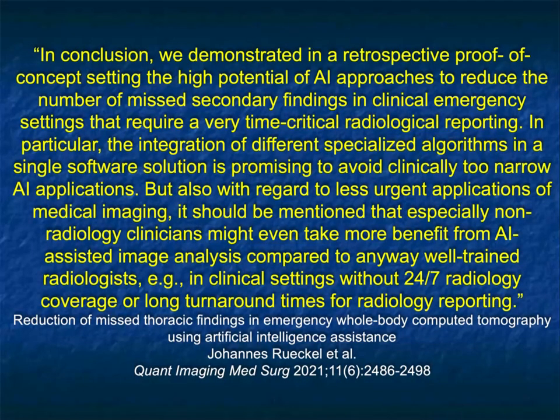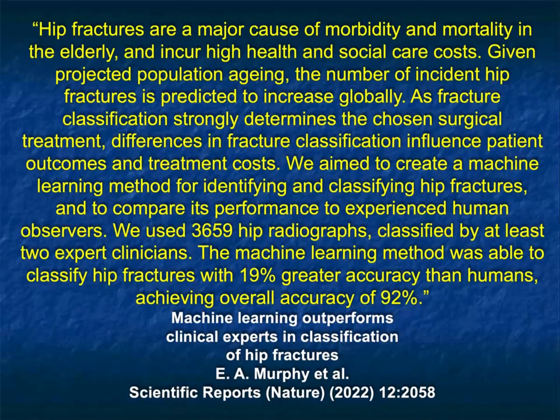And their conclusion was, in a retrospective proof of concept, that in the setting of the emergency room, where you're looking for a range of findings, it also is a situation where relatively, quote-unquote, minor findings can be overlooked. This would be a really good way of assisting the radiologist in clinical settings where you are looking at large volumes of images and where you really are overworked. So again, very much a similar conclusion.